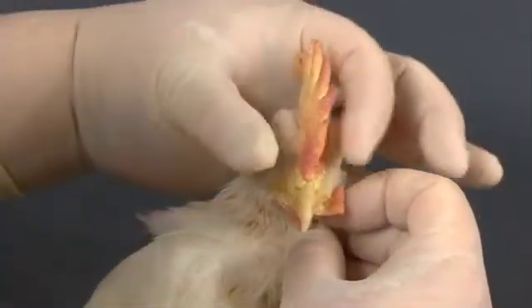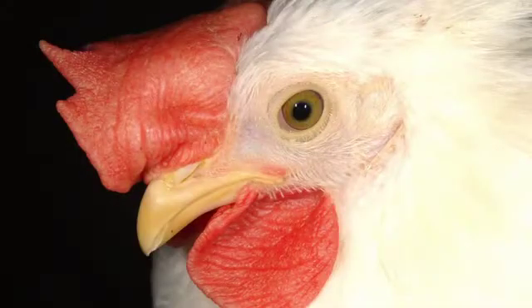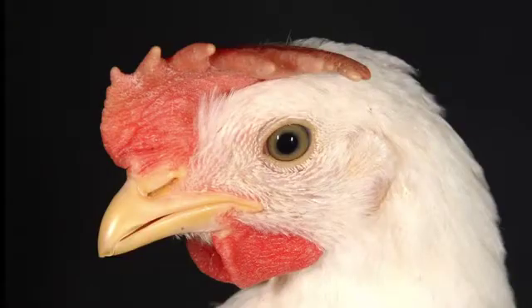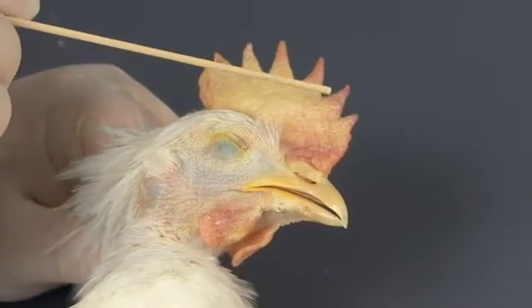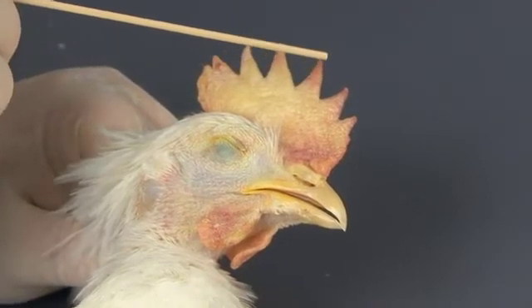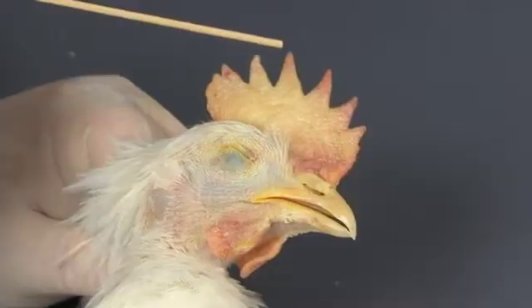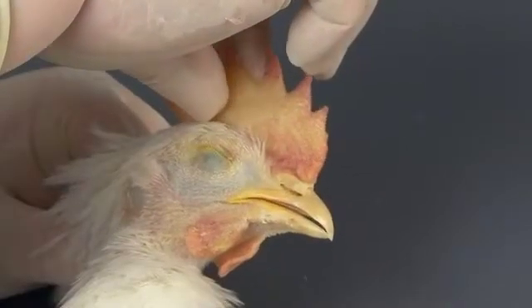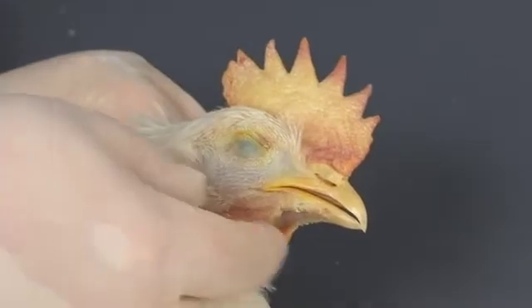Examine the comb and wattles. The size of the comb will vary, with the combs of males tending to be larger than those of females, and the combs of younger birds smaller than those of older birds. These outgrowths of skin are highly vascularized, making them a useful way to assess the bird's overall health. The comb and wattles are normally bright red. After death, their color will quickly fade, but they should remain firm and uniform on palpation.